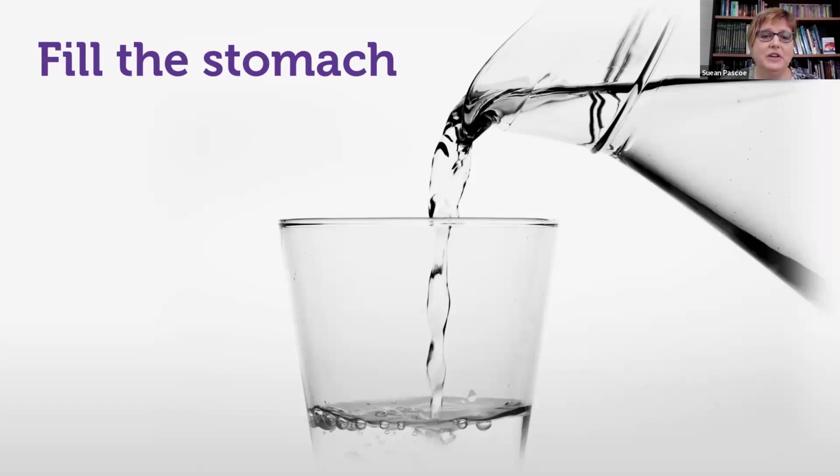Now, as I mentioned earlier, it's all good in theory. I haven't had a whole heap of success with this when I've needed it. I've occasionally had patients who've had a drink before they come in, and it happens to have worked, but it hasn't worked when I've needed it. But that might just be sod's law.